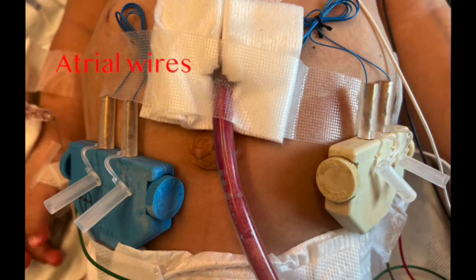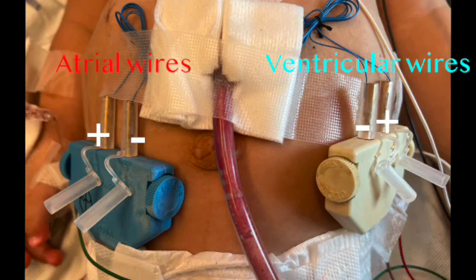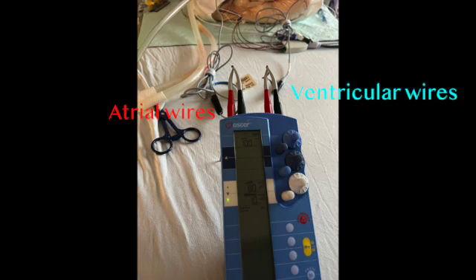There are two atrial wires and two ventricular wires, essentially a negative and positive terminal, which is necessary for electricity to conduct. These are then connected by cables to the pacemaker box. Atrial wires on the left of the box when it is facing you, ventricular wires on the right of the box. So if the box is at the end of the bed facing out, the cables won't cross.